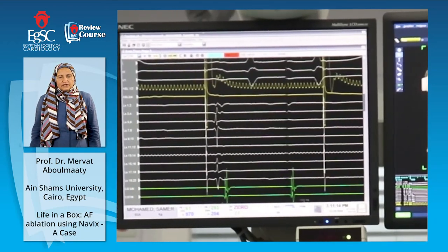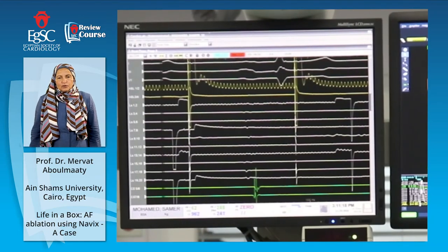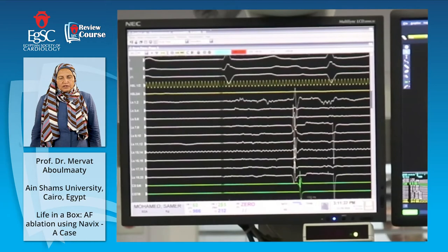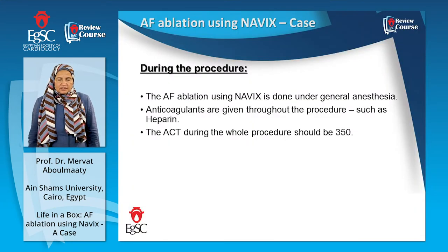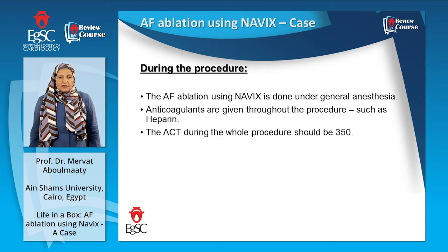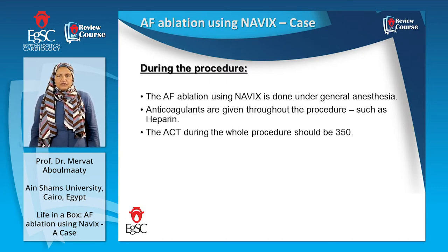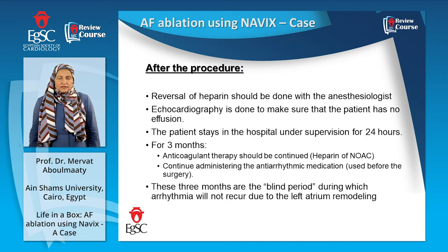I go with the ablation catheter again to every point I ablated on the ablation line to make sure that when I pace, I don't conduct into the vein, to make sure that everything is perfect. The patient is done under anesthesia, as I said. We have to give him anticoagulation. The ACT during the whole procedure should be 350. And after that, we finish, we take out the sheaths, and we make reversal of heparin with the anesthesiologist.